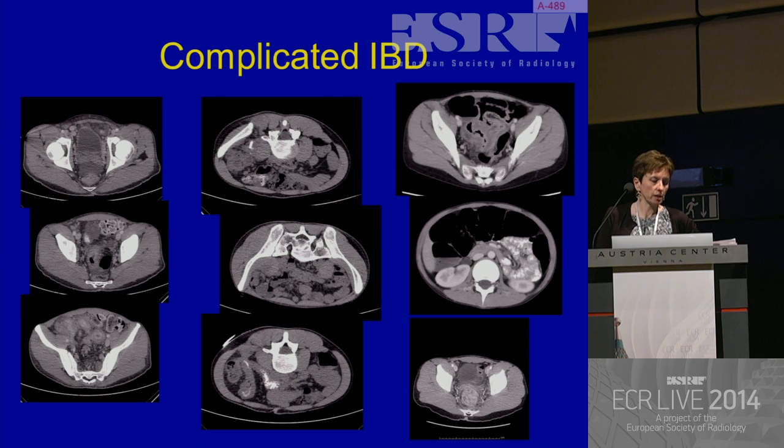And so what they wanted to do, and again, this is an adolescent patient, so my adult colleagues dealt with this, was they injected some water-soluble contrast medium through the indwelling pigtail and confirmed that there was still the fistula there. I have to say, as a pediatric radiologist, I may have opted just to do a fluoroscopic examination. But occasionally, again, pragmatism, these children are not necessarily managed by pediatric radiologists, and others may choose to do CT in that scenario.